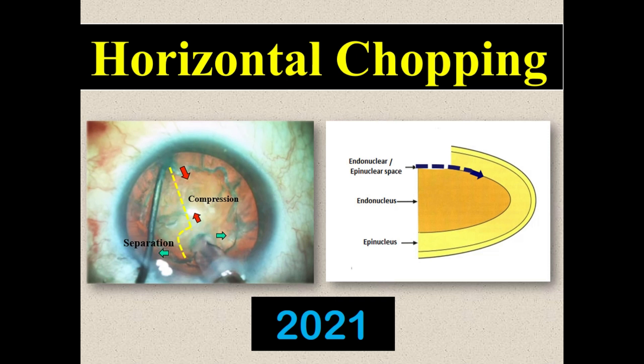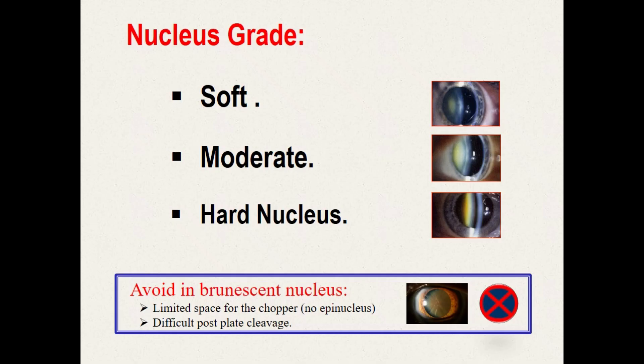Because of the several well-known advantages of pure chopping techniques, I invite you all to shift to and to master this technique. Horizontal chopping can be performed in different grades of nucleus hardness. However, because of the absence of cortex and even nuclear shell in brown cataract, there is no space to accommodate the chopper in a safe manner. So it is wise to avoid horizontal chopping in these very dense, huge nuclei.